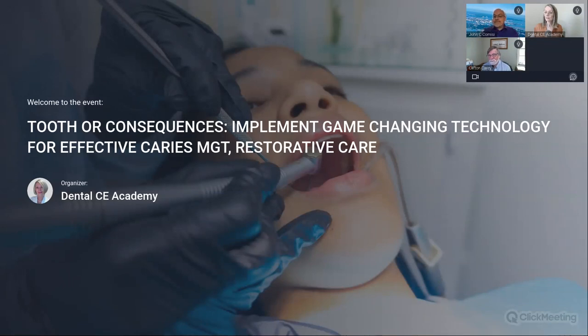John, I want you to know that I was one of the people who was curing those samples. It sure looked finished. But it wasn't. And we found out later by actually doing an extraction and saw that there was some MMA still there. Right. And again, it comes back to lights as well. If your light isn't curing effectively and you don't know it, you're also going to create more free monomer than you have activated monomer in the area. So that's why, as I indicated, light curing is a critical component of everything that we do, because it is also going to be a weaker composite if it's not cured properly. And if you don't get that degree of conversion, it becomes a real big issue as well.